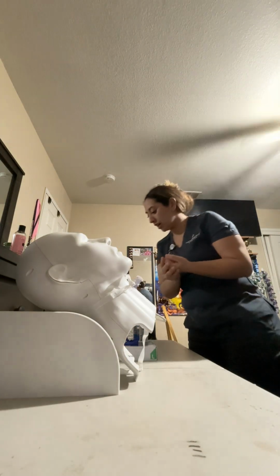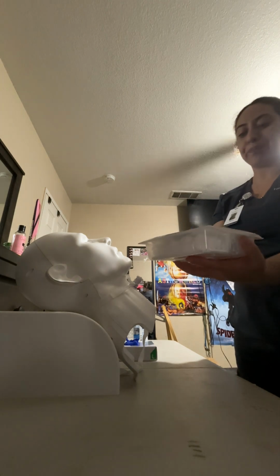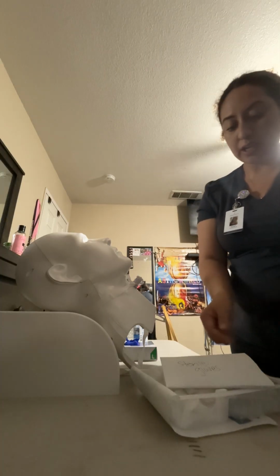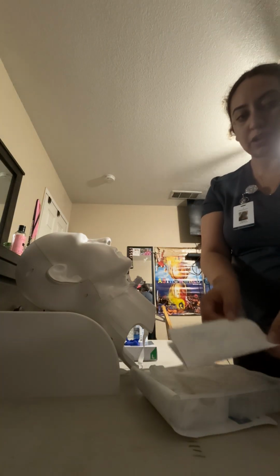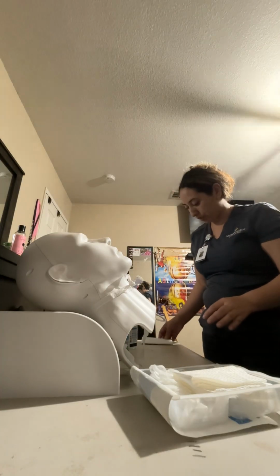So the next thing that I'm going to need for trach care is my tracheostomy clean and care tray. For this, I'm going to open away from me. So I will open away from the body. I'm going to place this down. So inside I have some sterile gloves. I'm going to move those to the side because I will use those at a later time.